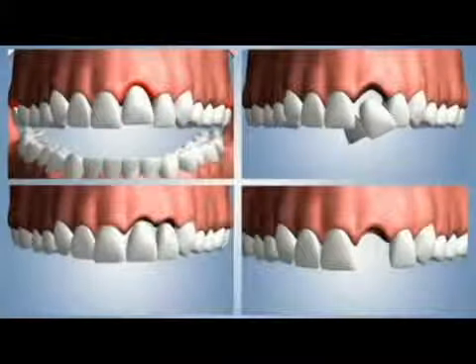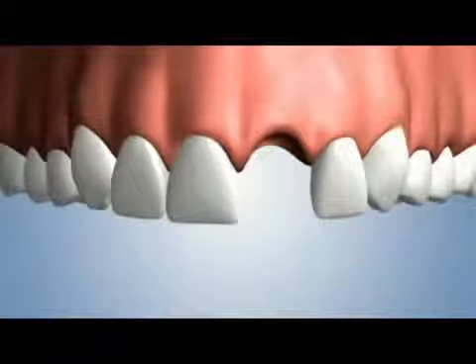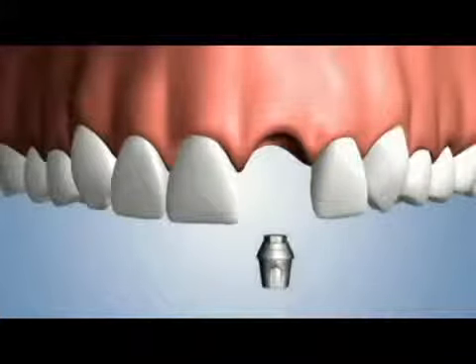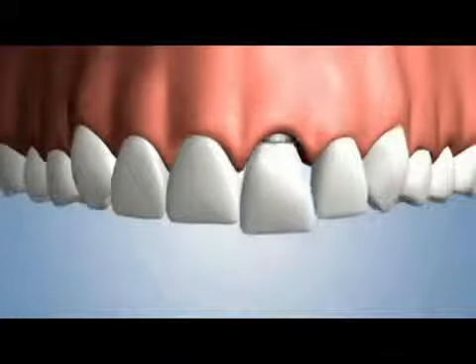to another failed bridge. The fourth option replaces the natural tooth root with a dental implant that is inserted into the bone. An abutment is secured to the implant, and a crown is secured to the abutment.